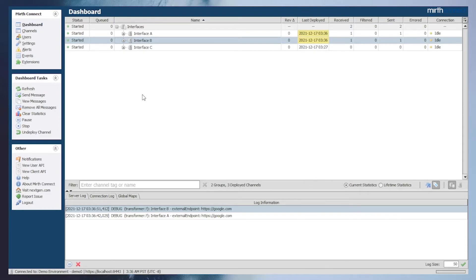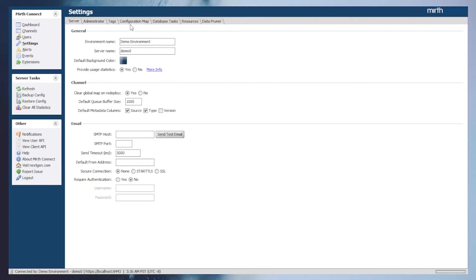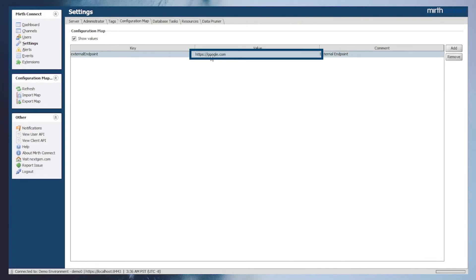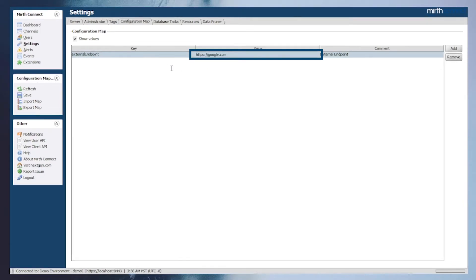Now that interface A and interface B are referencing the same configuration map variable, our system administrators have let us know that we must update where our request is going to. So let's head back to the configuration map tab under settings and go ahead and update the configuration map variable that we just created. We can just double click the variable entry that we want to modify, and then click Save once we're happy with the changes.